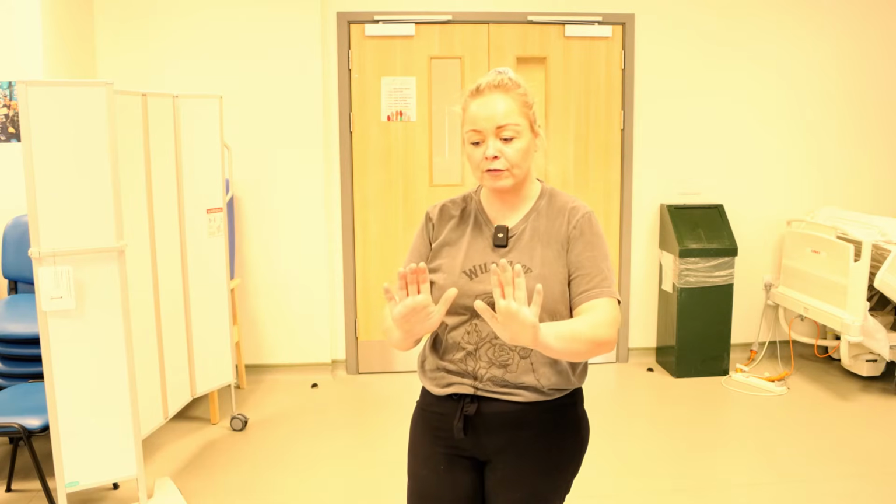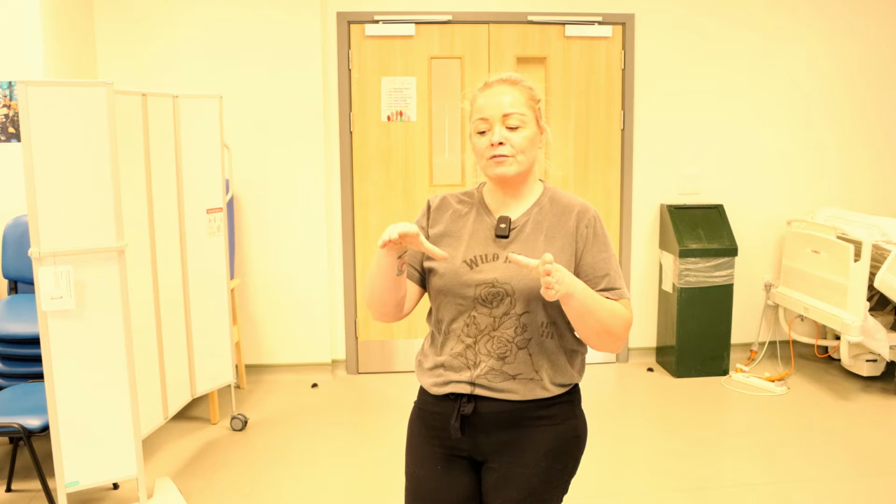So I'm just going to give a little visual representation of what I'm trying to do when we're squeezing the bag for the inflation breaths compared to the ventilation breaths. The purpose of the inflation breaths is we're trying to push that fluid out. Some midwives tend to do the inflation breaths far too quick. We have recorded the time length of some people's inflation breaths and they range between 1 to 2 seconds. We want them ideally between 2 to 3 seconds because the idea is you're pushing that fluid out of the lungs. If we go too quick, it's just going to keep coming back in.